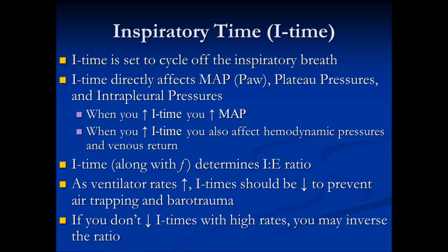So I time directly affects your mean airway pressure, or your PAW, plateau pressure, and your intrapleural pressures. So since I time directly affects those things, when you increase your I time, you will increase your MAP. Very important.